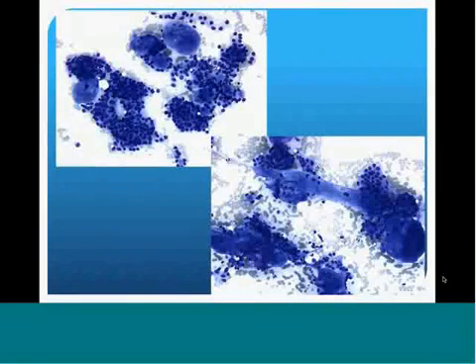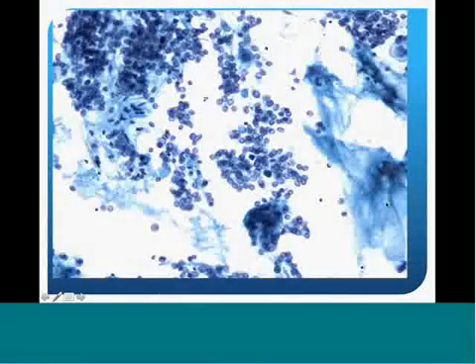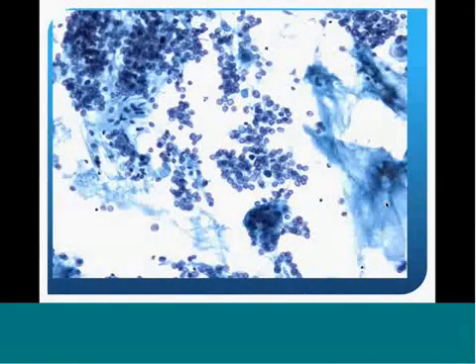And you notice it has a lot of branching papillae, and there's also chewing gum colloid, which is this kind of gummy, round colloid, and the follicular cells are kind of surrounding it. This is a Pap stain, and you see that these nuclei, again, are also very abundant.